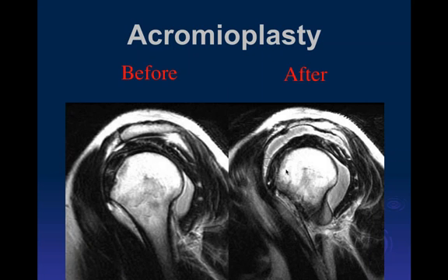I don't really know why they did an acromioplasty on this patient. I think they didn't do surgery because of the imaging. They did it just out of clinical concern. And this was kind of in the early days of MR, where I think the surgeon might not have been as comfortable with the MR findings as we may be now. Yeah, arthroscopy of the shoulder came about just about the time that MRI came about, a little earlier than MRI. A little bit, yeah. And so people really didn't know that much about this area.